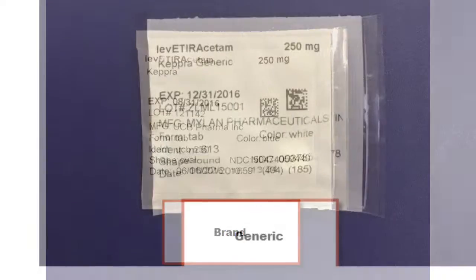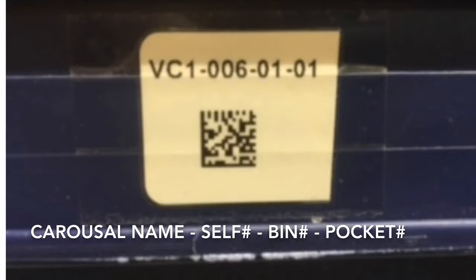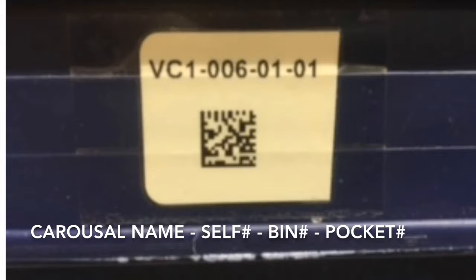The generics are kept in the carousel and on the cart fill wall. The carousels are organized by carousel name, shelf number, bin number, and pocket.